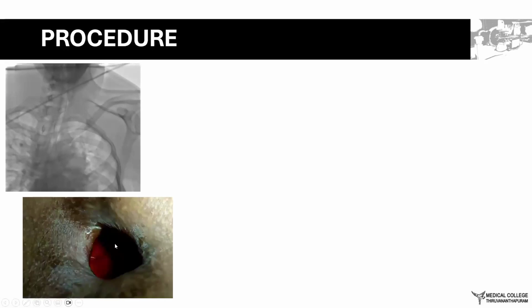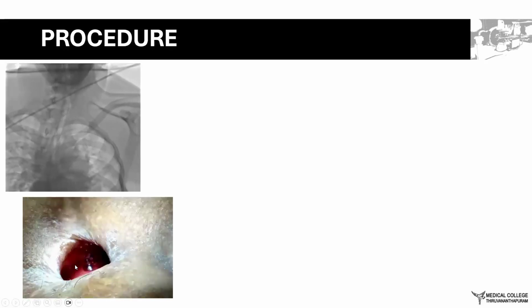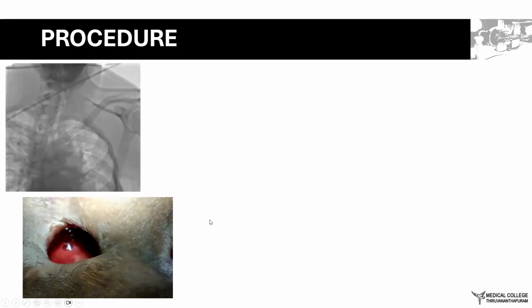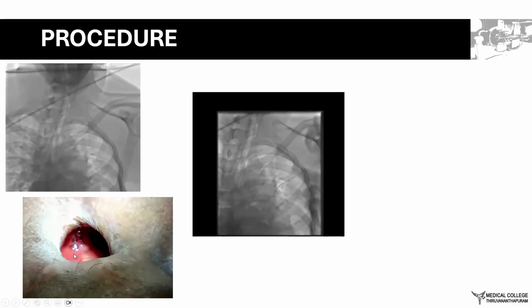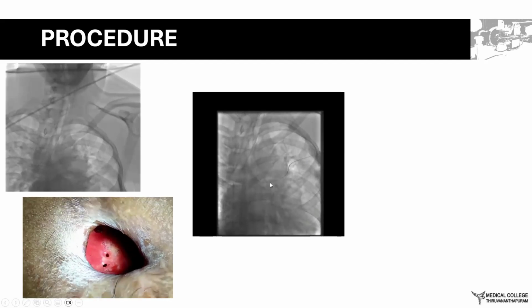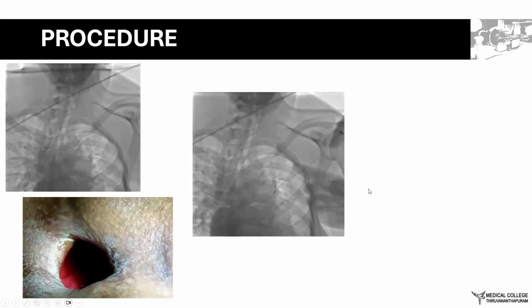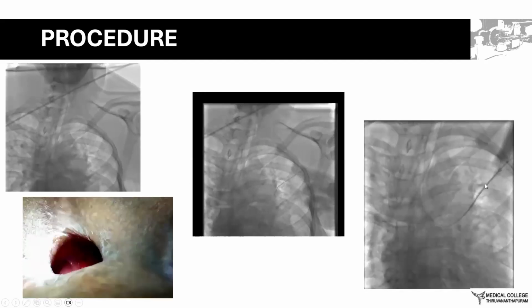So the patient was intubated and then this was the pre-procedure. So through the skin, we put some saline just to see the bubbling in the orifice through the peripheral bronchiole. And then through the skin, through the opening in the lung surface, we have passed a small radial sheath wire. So this is basically a 0.025 wire, which we have passed into the bronchus. And then once the wire was in situ, we have passed a 6 French sheath into the peripheral bronchiole through the percutaneous approach.